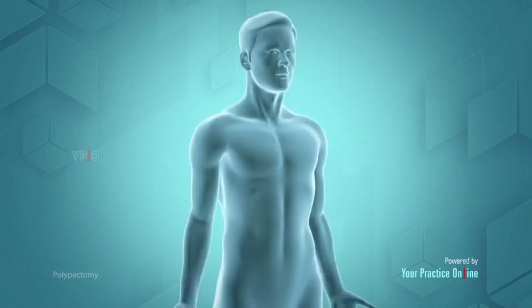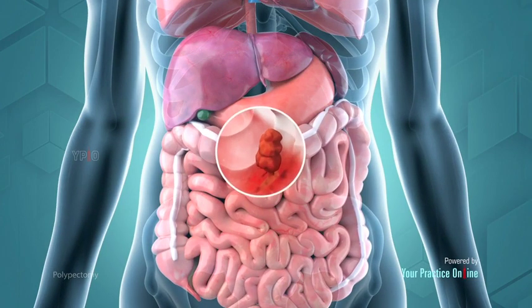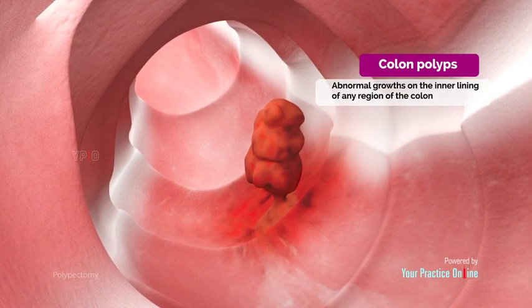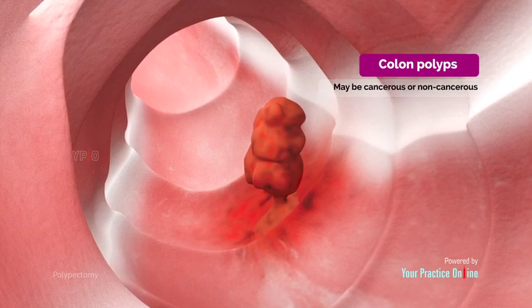Introduction. A polypectomy is a surgical procedure to remove an abnormal mass of tissue called a polyp that develops on the inner wall of a hollow organ. A polypectomy is most commonly used to remove colon polyps. Colon polyps are abnormal growths on the inner lining of any region of the colon. They may be cancerous or non-cancerous.